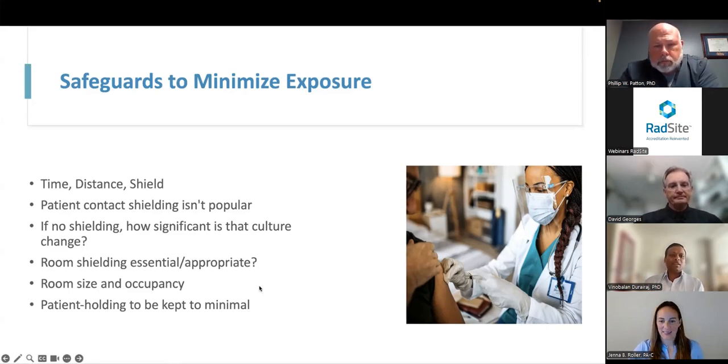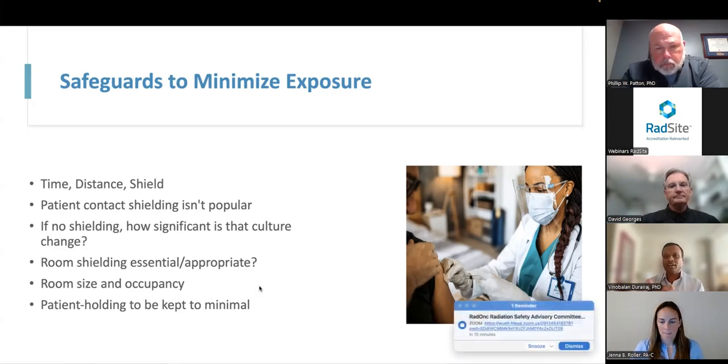Talking about the other things about safety, the last one, I have this question to find out about patient holding. I know that, David, in your case, it's not as much of a question. Jenna, do you see it as a normal practice where patients need to be held, or is it kind of going away these days? Do we have anything in the CurveBeam CT area that helps patients so that they don't need any holding anymore?